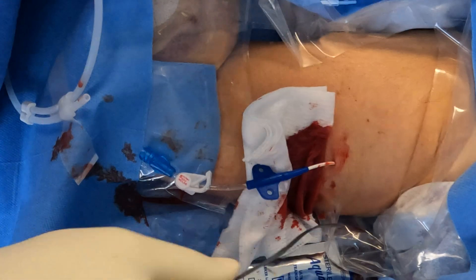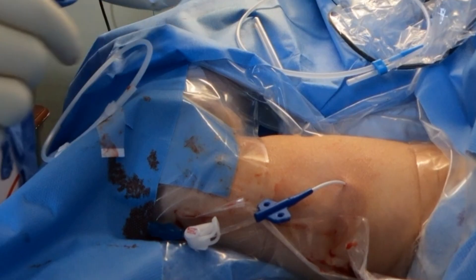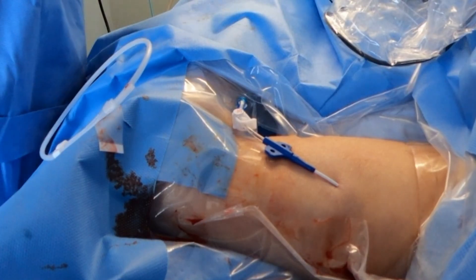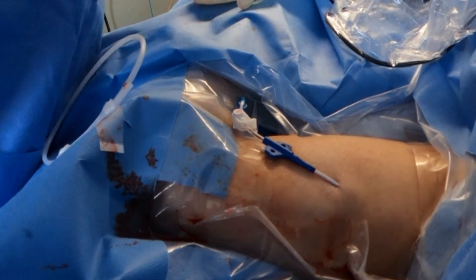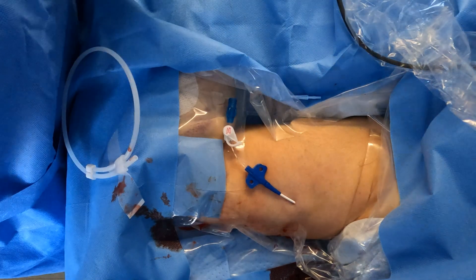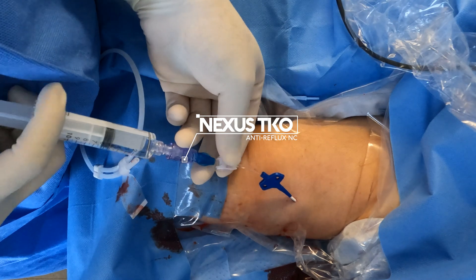You did so good. Okay, so I'm going to move that out of the way. What I like to do at this point is clean off any blood at the site and change out gloves. Today we'll be using the TKOs — these are the needleless anti-reflux connectors. They're fantastic for preventing reflux back into the catheter during flush, and it eliminates human error.